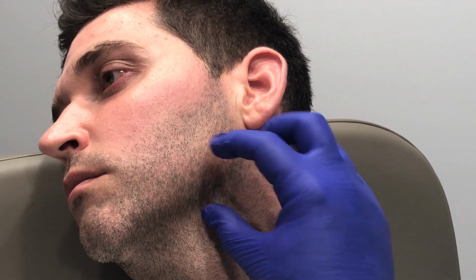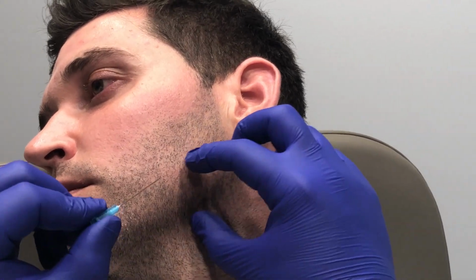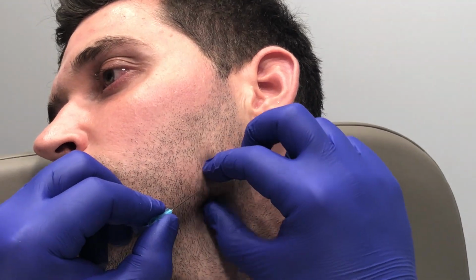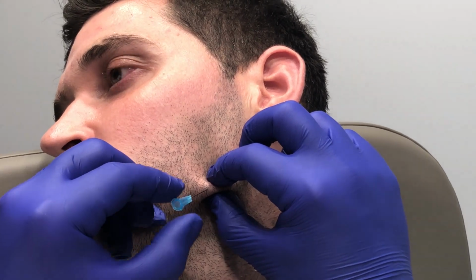So my technique itself is going to be to just port and place my needle. This looks like a long needle, but we're only going to use just the very, very tip of it just to create a little definition. So a small little pinch. Good.